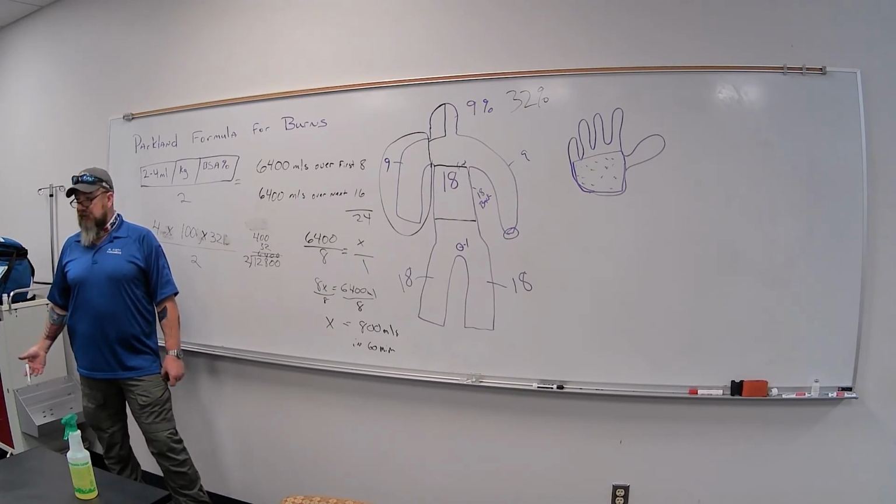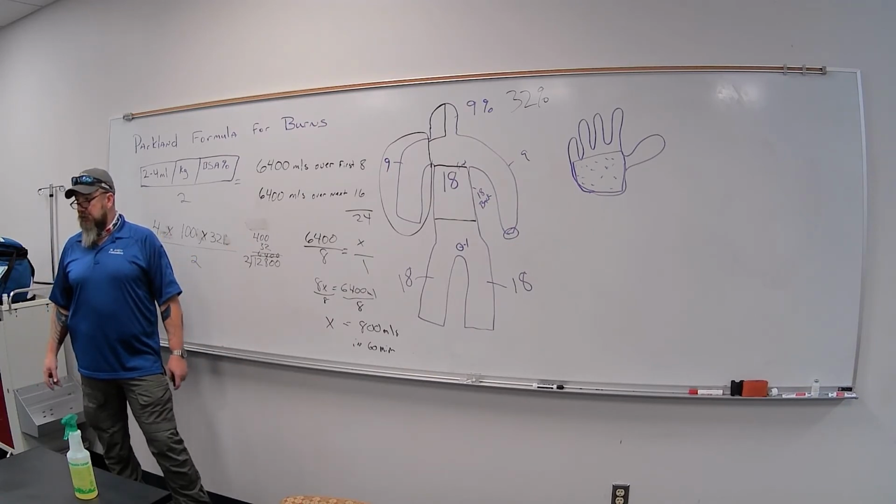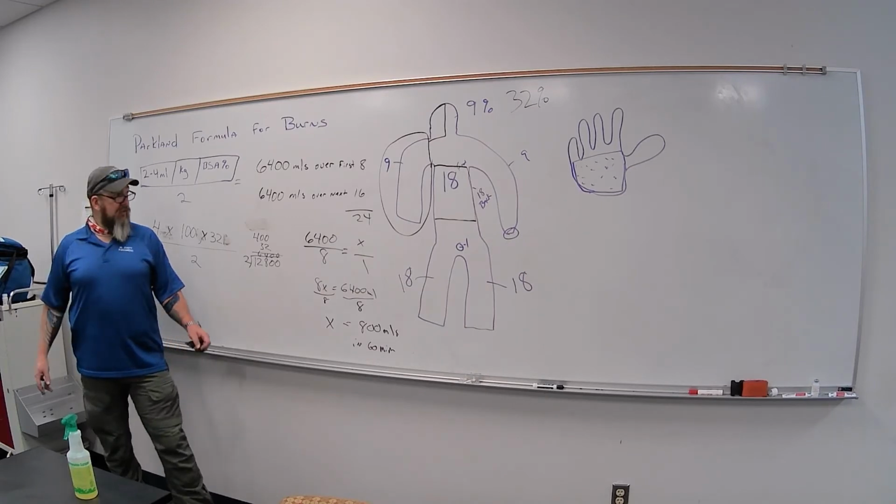Why are we not using 60? After we already know the 8 hours, we wanna know within the first hour, which is 60 minutes. Well, this breaks it down by an hour, right? It's in hours, okay? So if you wanted to get it in minutes, you would have to divide this by 480.